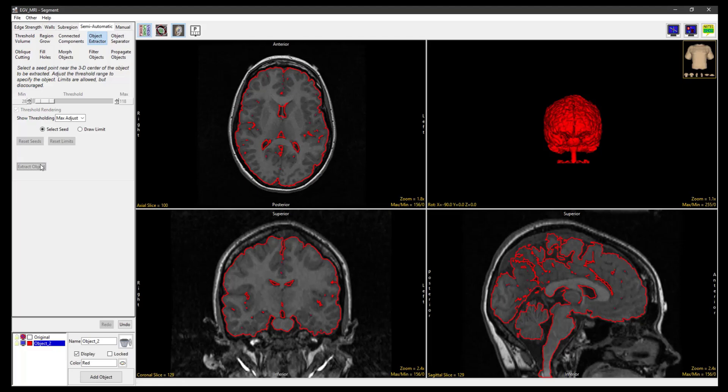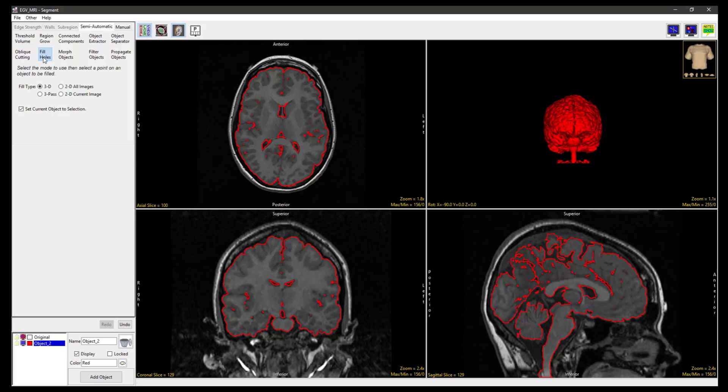To remove small holes in the object, which are the result of segmentation parameters, select Fill Holes. With the Fill Type set to 3D, click on the object to fill smaller holes in the object.